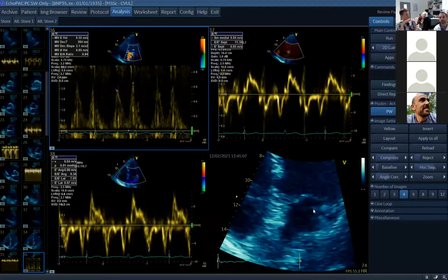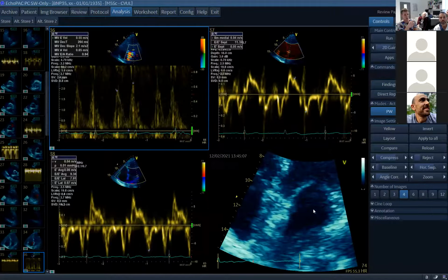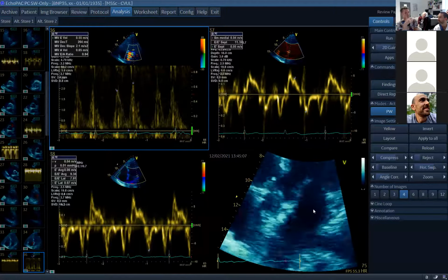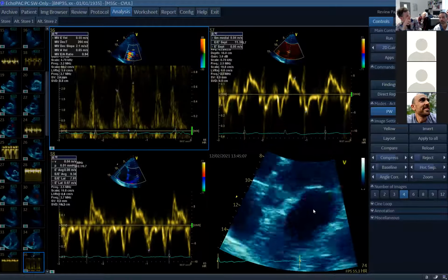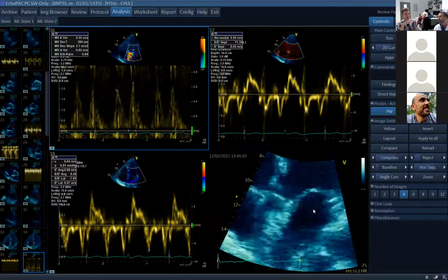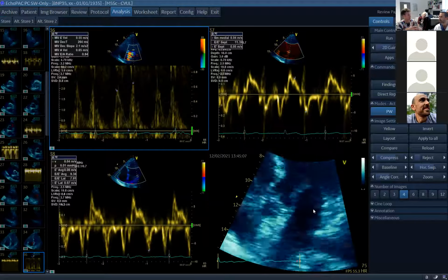Because if you've got chronic systolic dysfunction as bad as this, and then with inotropes you'd expect it to be even more reduced, and he's got the left atrial size as normal, that's suddenly starting to add up. And I would be putting on the form, this has cardiac features that may be consistent with a septic cardiomyopathy, and that's what the examiners would be expecting.